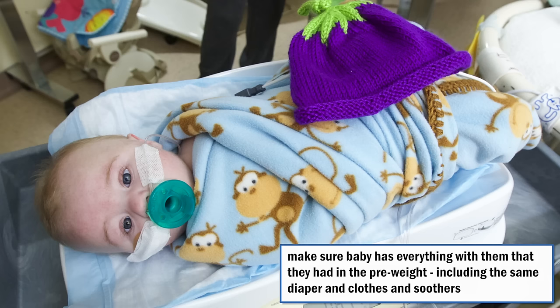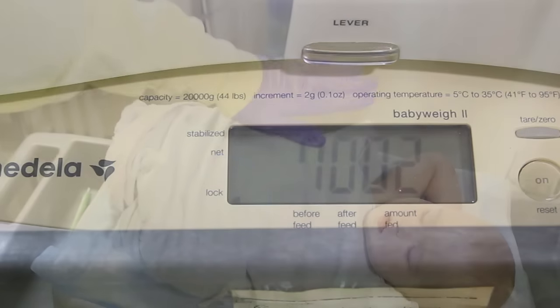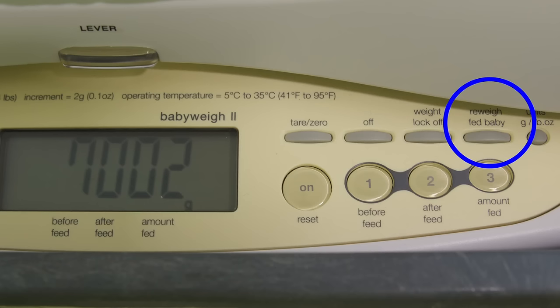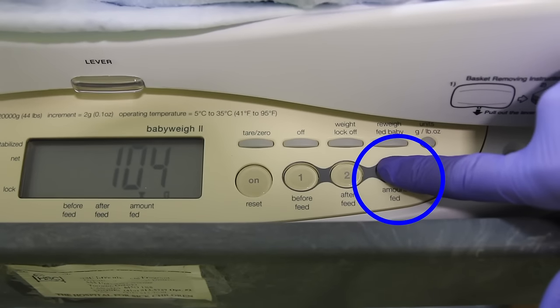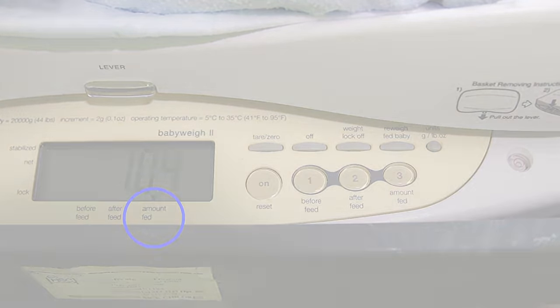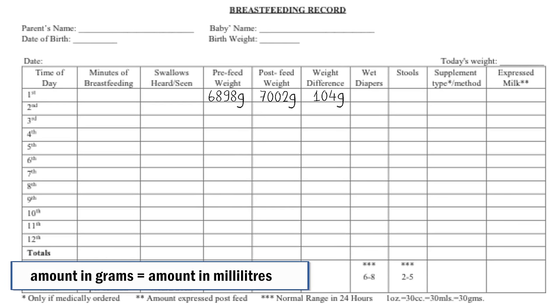Place the infant back on the scale in exactly the same way as before. Wait for the beep and lock, with your hand hovering over the baby. If you do not manage to get all the lines on the scale before it locks, press 're-weigh fed baby' and wait for the lock. Press 2 while the baby is still on the scale to input the weight for the calculation. Notice the arrow moves to 'after feed.' Press 3 to see the weight gain. Notice the arrow moves to 'amount fed.' Record the post-feed weight and weight difference on the breastfeeding record. The amount shown in grams is equal to that same amount in milliliters.